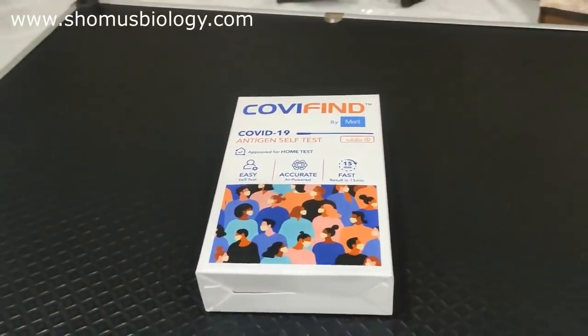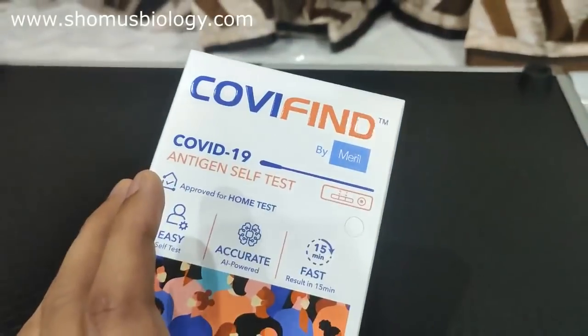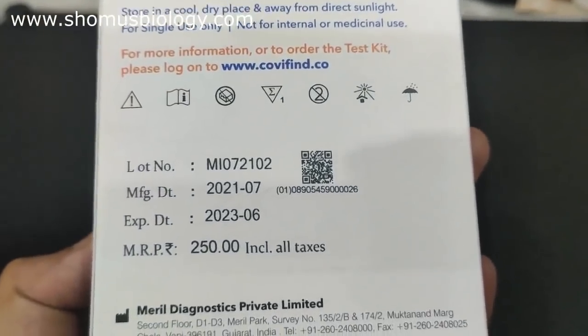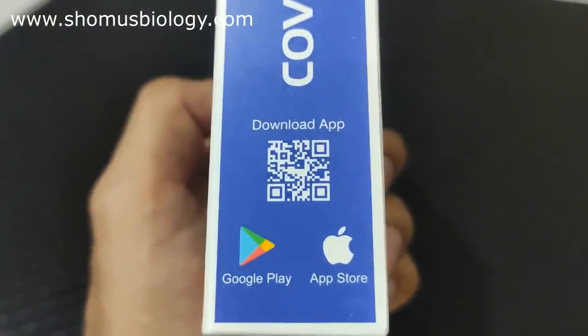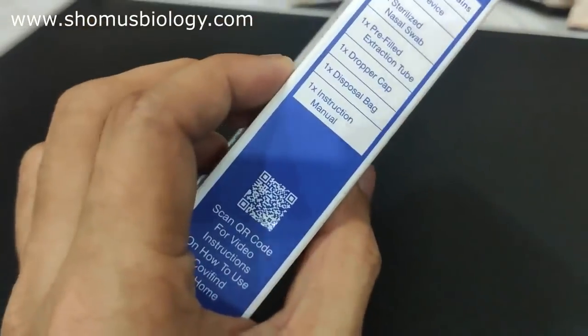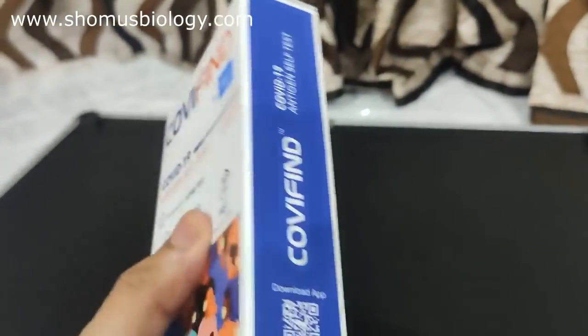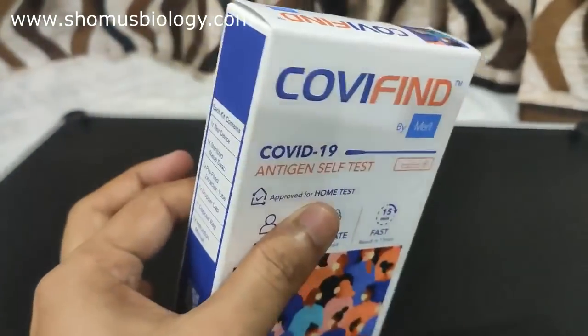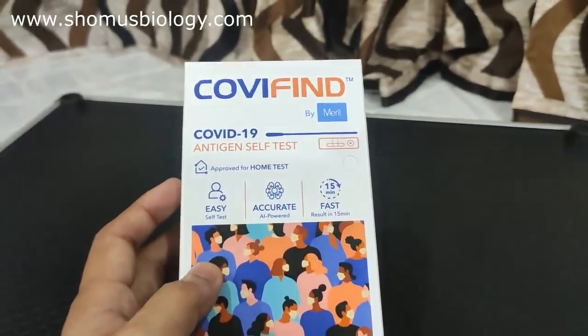We'll also talk about the positive and negative sides of Covifind. This is the test kit by Merrill Life Sciences — it costs 250 rupees, the same price as Coviself by MyLab. It is also an app-based test kit with its own app on Google Play Store and the App Store. It comes in a cardboard box, which I think is a better option than a plastic one.